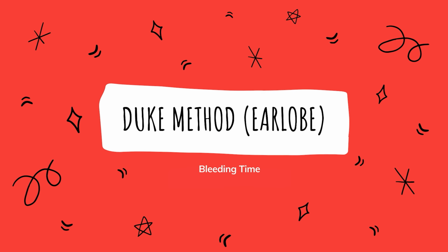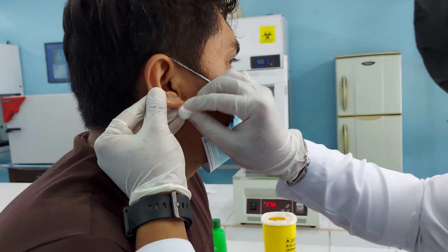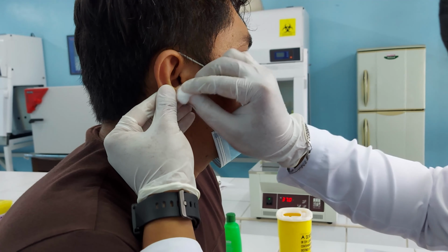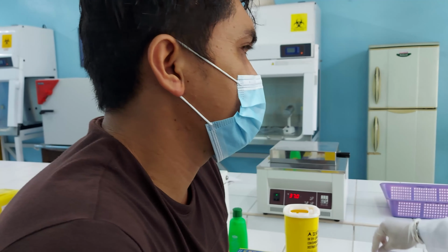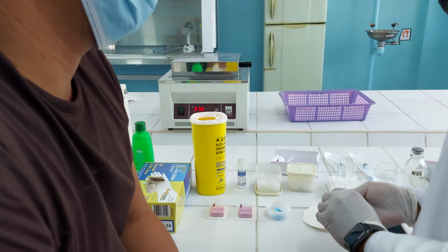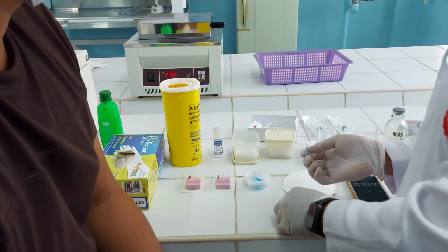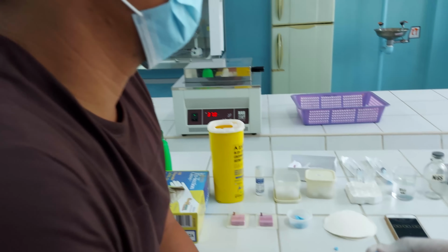The first method that we'll be performing is the Duke method in the earlobe. To start, we are to clean the site with alcohol and allow it to dry. Pierce the earlobe with the lancet, making the incision 3 millimeters deep, and then start the stopwatch immediately after the puncture. After that, blot the blood with filter paper at 30 seconds interval.